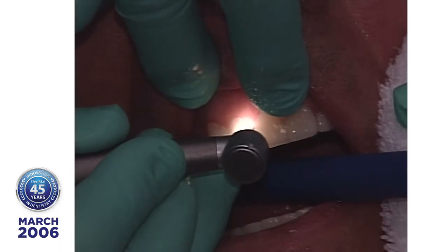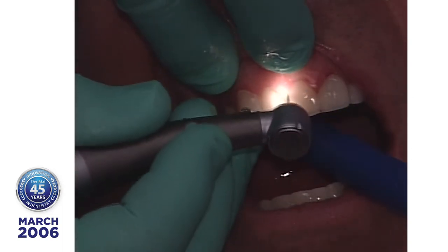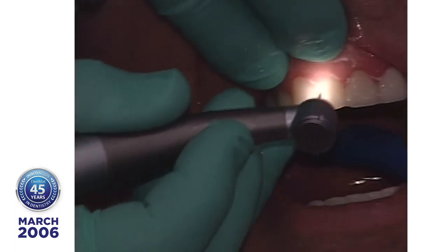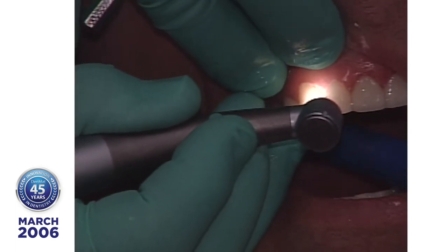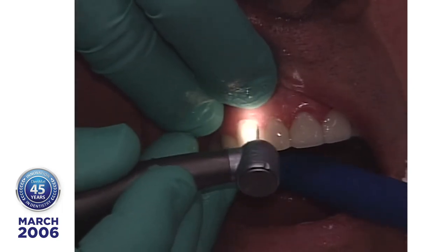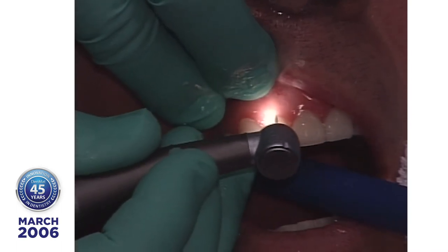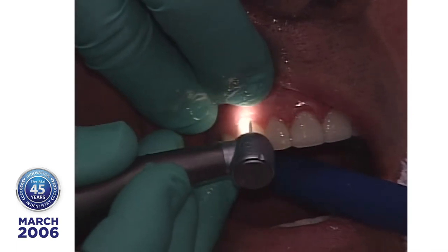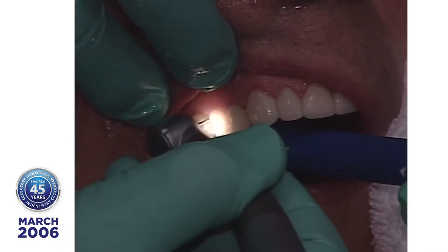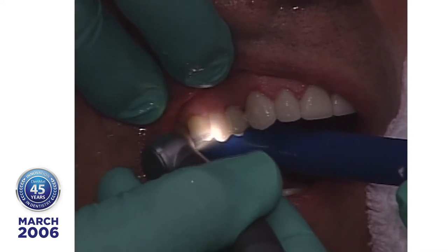And the most frequent question I get is, why didn't I use dental floss to open the contacts? And I think I told you, because I'm scared to, because when these contacts are just right and you put the thickness of floss in there, you're liable to displace them. Even with the technique of half curing and then coming back in the full way and all that, I'm not interested in ease of finishing. I'm interested in, as my primary objective, getting a stress-resistant, non-microleaking restoration.